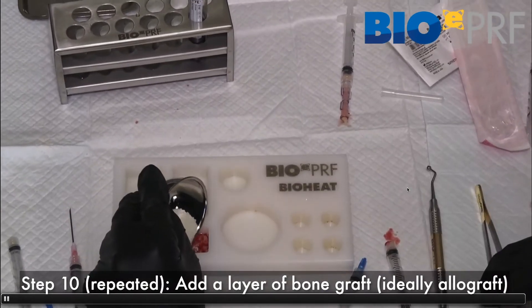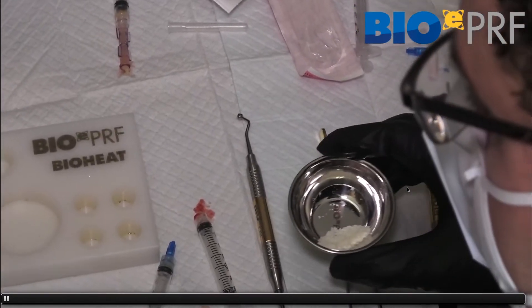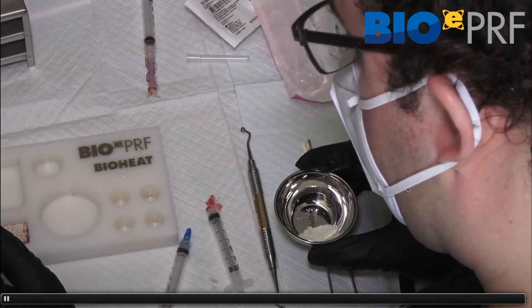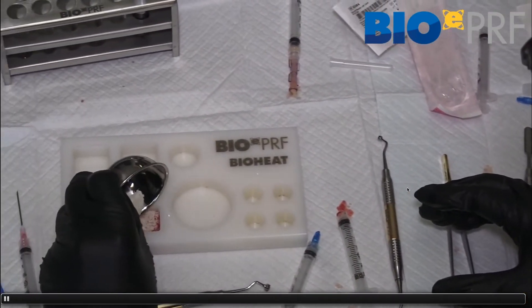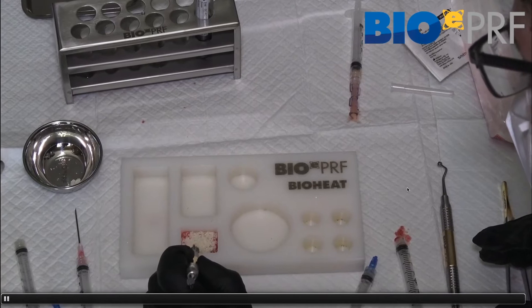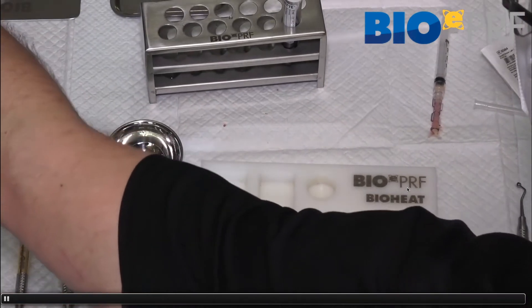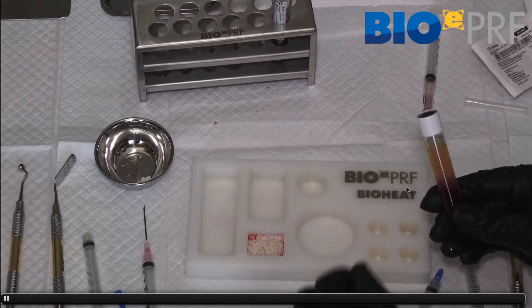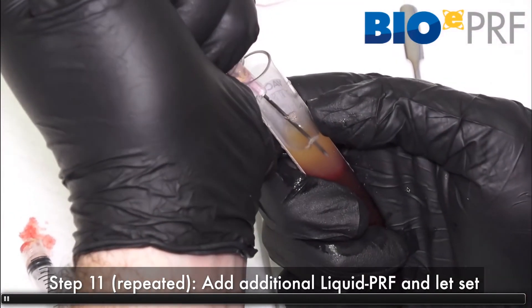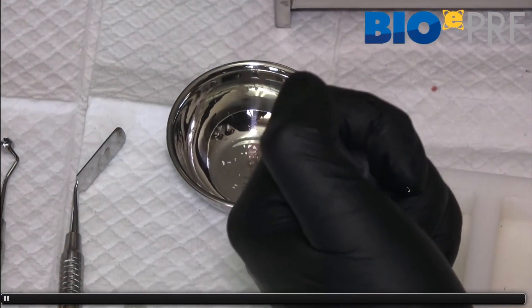Now what's different is that before this clots, we incorporate sticky bone. We take the sticky bone and incorporate it here — adding some bone allograft, using the compactor to flatten it out, making sure it's nice and flat. Then we add the liquid platelet-rich fibrin. When making the biobone, I'll always draw one or two extra tubes of liquid PRF — a full size liquid PRF tube — on purpose, because this requires a little bit more liquid PRF than just the CPRF layer.